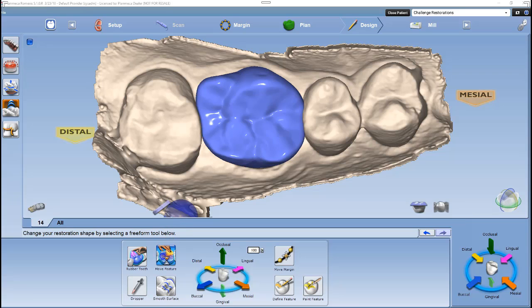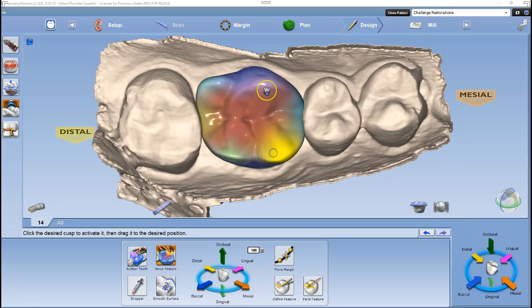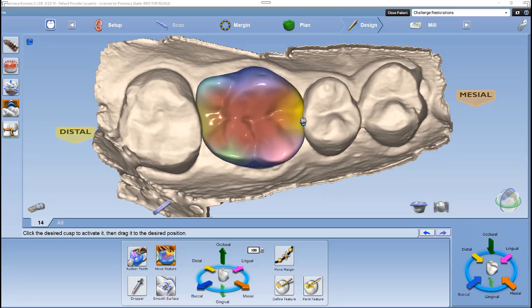Let me start out by explaining how move feature works. Once I left-click the move feature icon, we see that the tooth changes to multiple colors on the occlusal table. These are functional areas of the occlusal table. We can activate different areas such as mesial, distal marginal ridges, each cusp tip, and the occlusal table by left-clicking in the area and highlighting it.